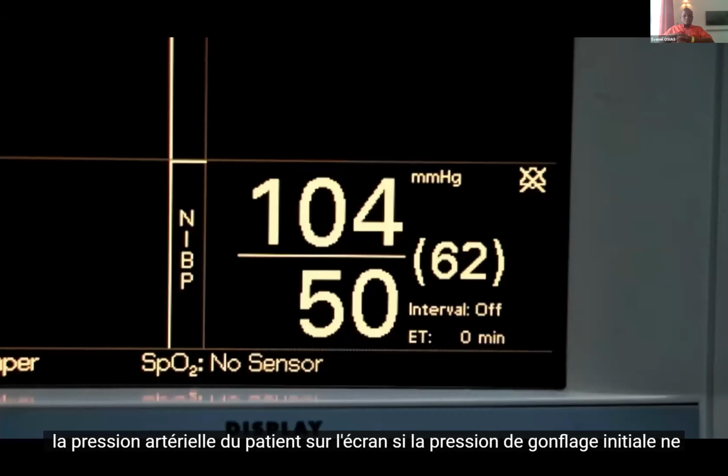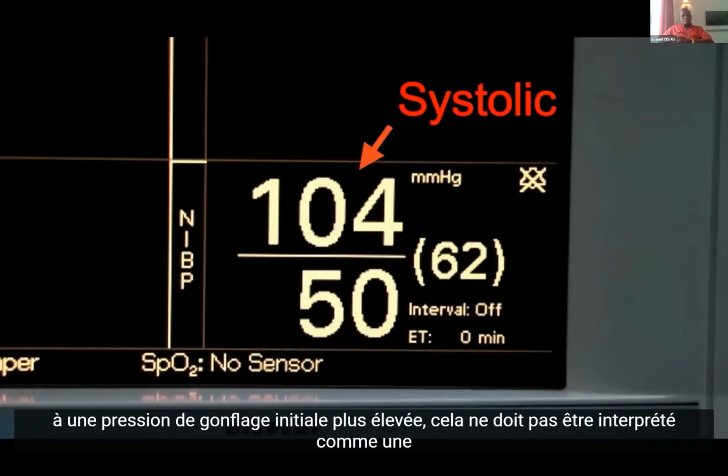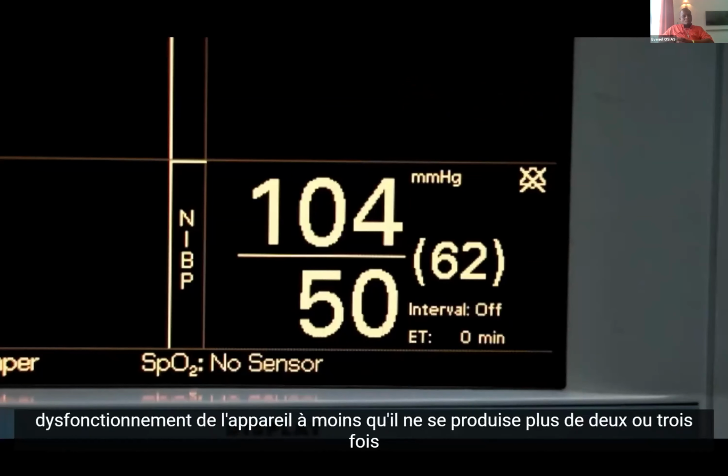If the initial inflation pressure does not go above the systolic pressure, the device may try to inflate the cuff again to a higher initial inflation pressure. This should not be interpreted as a malfunction in the device unless it occurs more than 2 or 3 times.